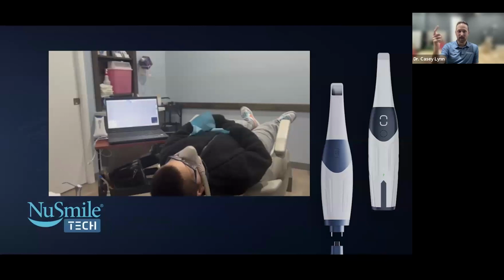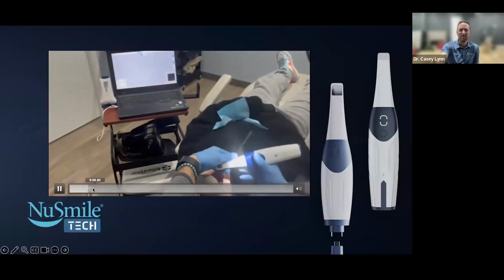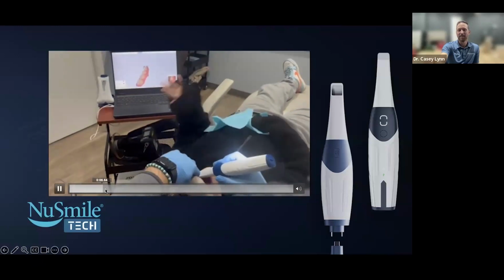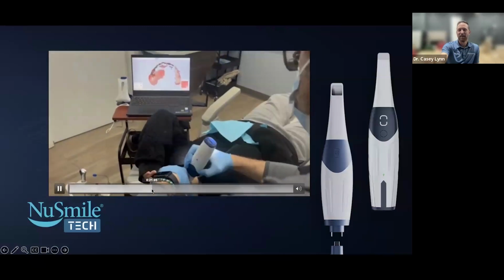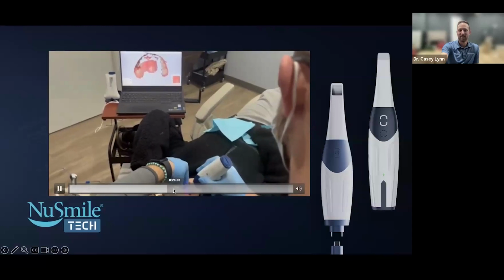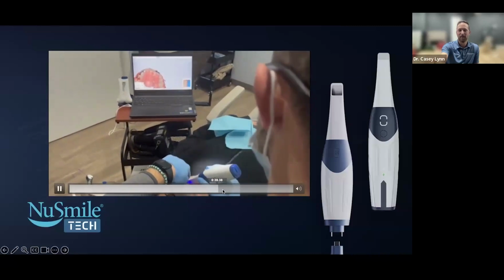So I had my sealants done, SOAN, anesthesia complete, and then did my scan. Is this me rolling through? Yeah, this is me. That's me putting my gloves on, and it's locking up here, but you'll see I'm not as slick as my assistant Angelica. It's glitching on the video, but he got through it. He's a heavy gagger. He gagged probably 5 or 6 times during this. He definitely would never have been a candidate for a full arch impression without throwing up in your op.